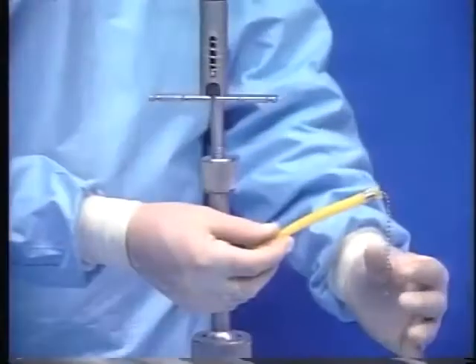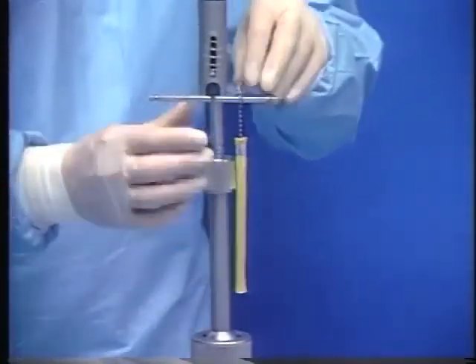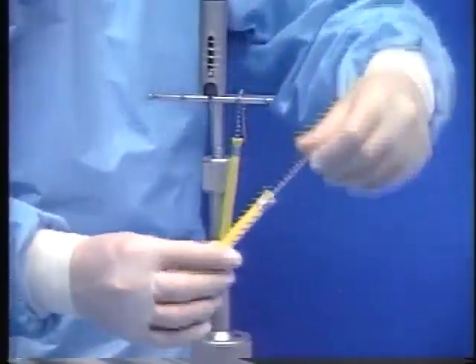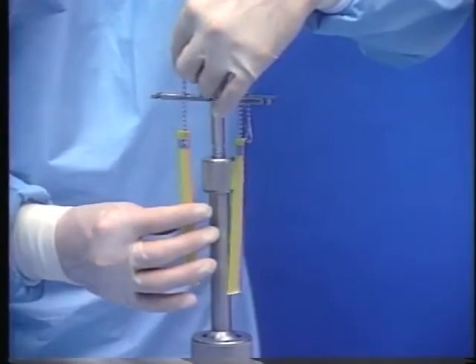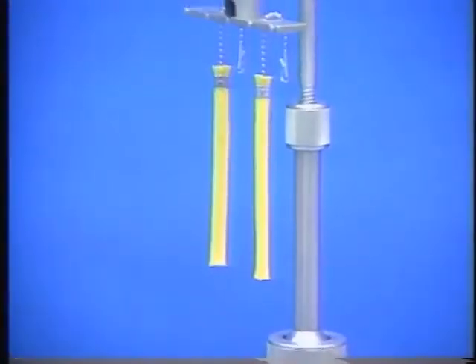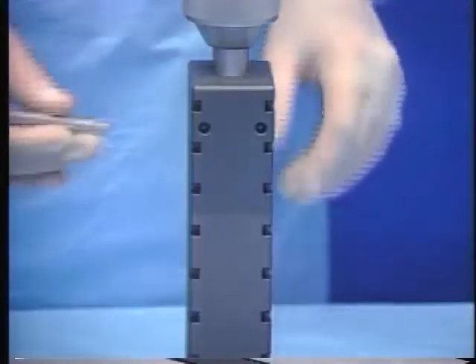The last step of the Traction Tower assembly is the attachment of sterile Linvitec Digitraps. Linvitec Digitraps are made of atraumatic nylon material, providing skin contact over a greater surface area in comparison to standard finger traps. The ball and chain aspect of each Digitrap is attached to the slots of the Traction Scale.